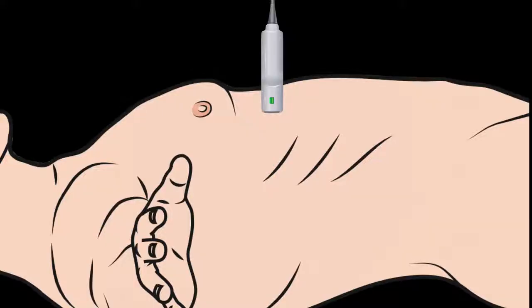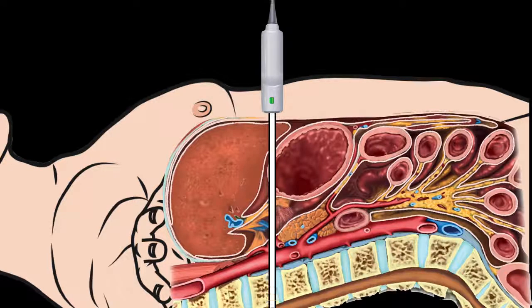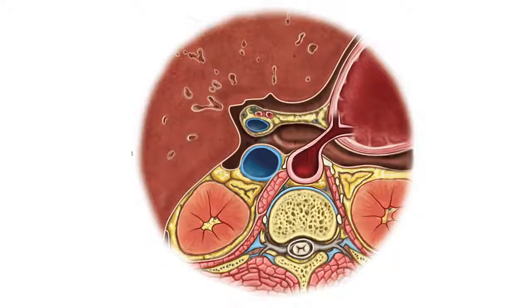Viewing the proximal aorta at the subxiphoid process can be somewhat difficult because the probe cannot go more proximal as it is inhibited from traveling superiorly by the xiphoid process in the rib cage. When you get this view here, most commonly you'll be seeing the celiac axis. And what you'll see is the celiac axis coming off the aorta with its two branch points. If this is visualized, this is already the mid-aorta as it is distal to the celiac takeoff.